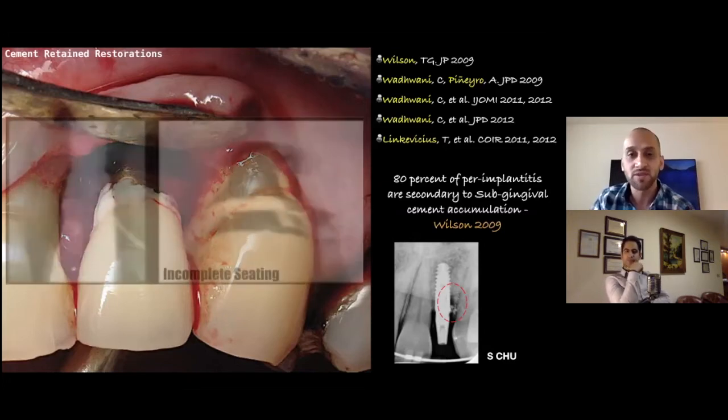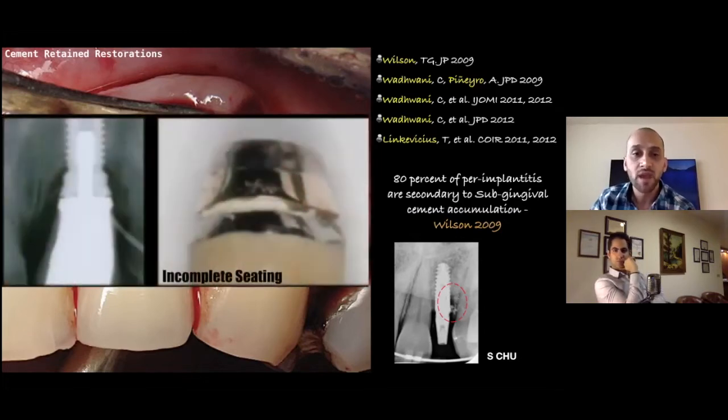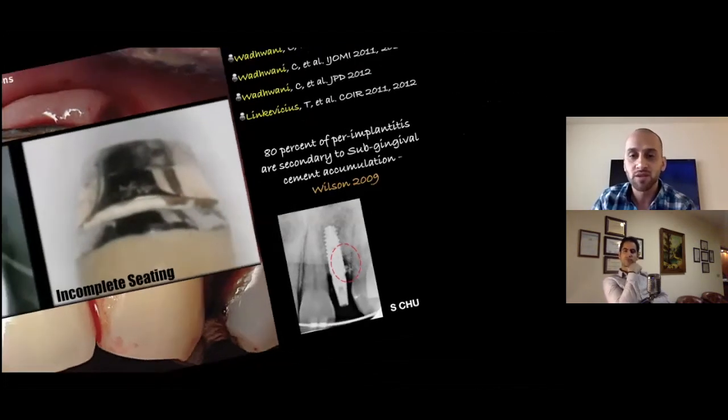The other problem with cement retention is also the incomplete seating. Sometimes people use cements that set before the crown is seated fully. So you get incomplete seating, but you don't see that. You have an increased occlusal adjustment that is needed. And so you're sitting in there and you're grinding the whole beautiful occlusal anatomy away. And the problem was that it was incomplete seating. And it's sort of an irreversible situation at that point, not only for you, but for the patient. You can't start over, so you just kind of leave it. And that gap accumulates bacteria and biofilm, and over time it creates some other problems.